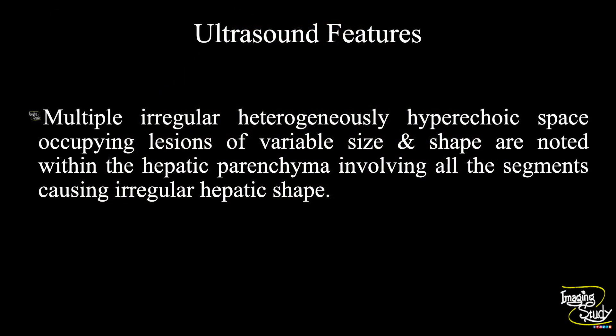In summary, multiple irregular heterogeneously hyperechoic space occupying lesions of variable size and shape are noted within the hepatic parenchyma involving almost all the segments, causing irregular nodular hepatic shape. This feature is suggestive of a case of hepatic metastasis.